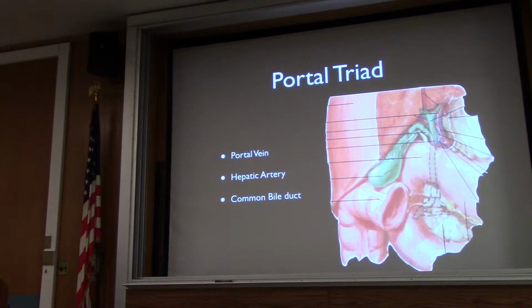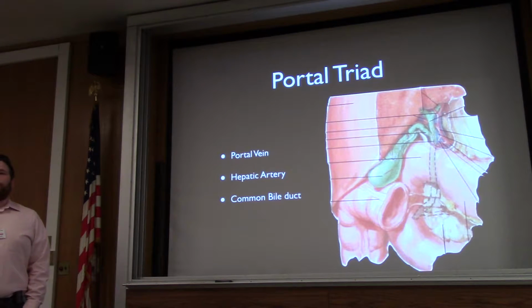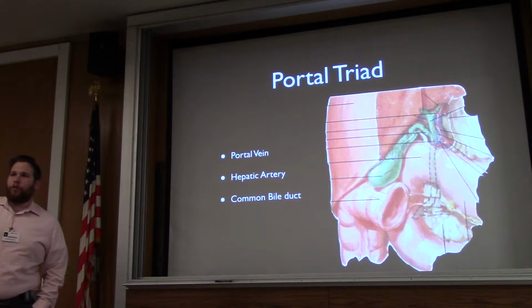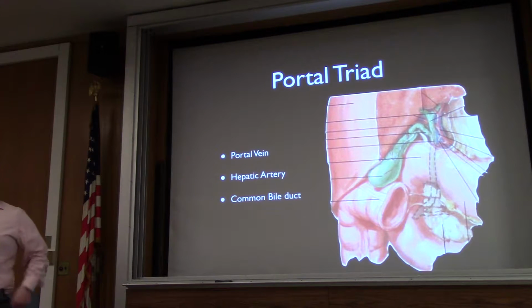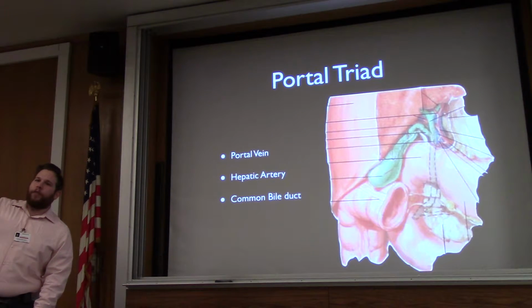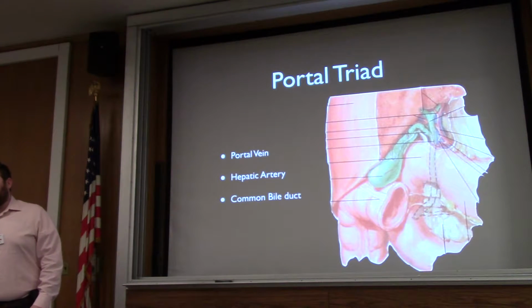Is it correct that it has to be in the cross-sectional view to look at the anterior wall? Okay, so I do try to always do it in the cross-sectional view, and I think the reason for that is the radiologist will usually measure the wall in the short view, just because if you get it in the long view, if you go over just a little bit, you can kind of catch the curve on the side, and it can look thicker than it actually is.